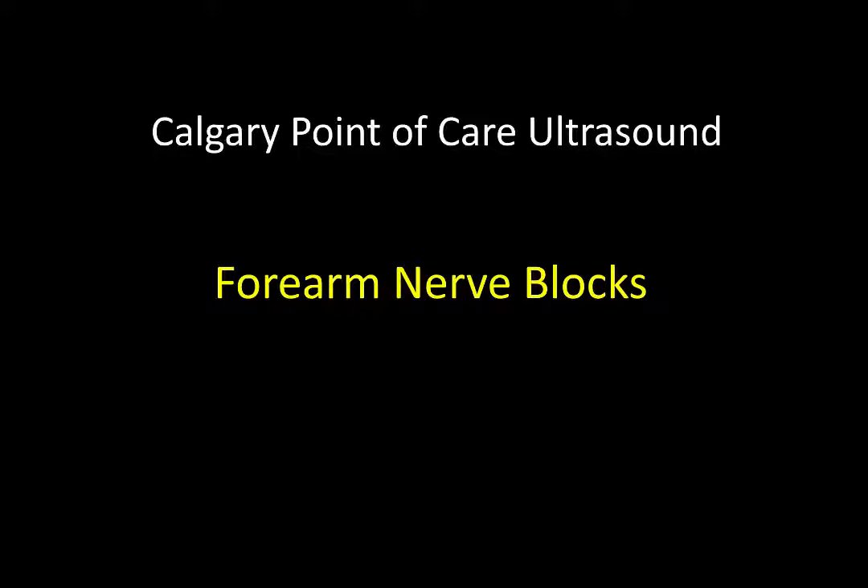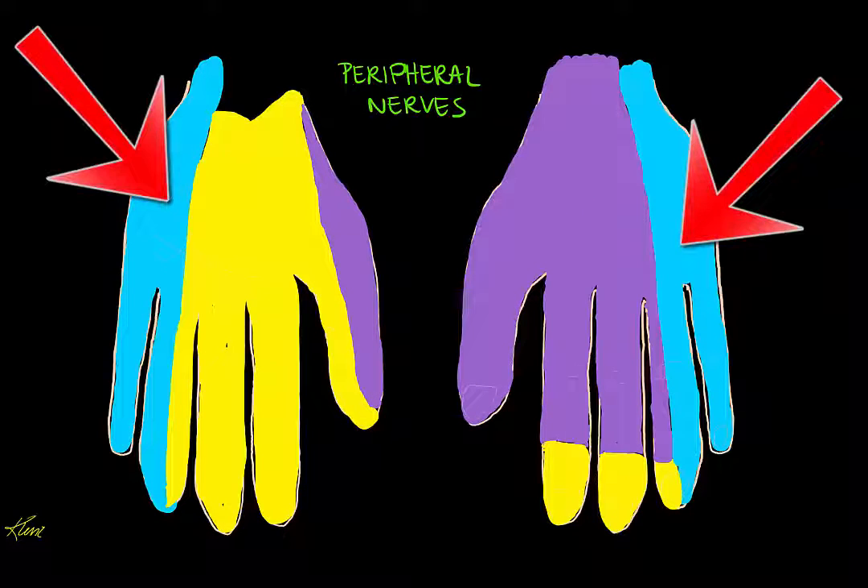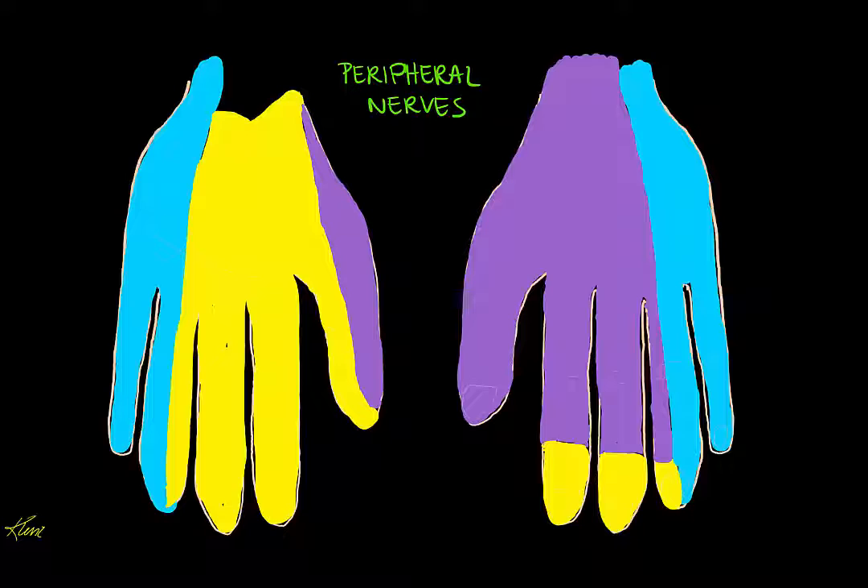Welcome to the University of Calgary point of care ultrasound tutorial on forearm nerve blocks. In this tutorial I am going to show you how to perform ultrasound guided regional blocks of the radial, median and ulnar nerves at the level of the forearm. These forearm blocks are great for fractures or lacerations at any level below the wrist. By doing these quick blocks at the level of the forearm, you don't have to worry about missing the very superficial branches of the nerves, which ensures a more complete block for your patient.